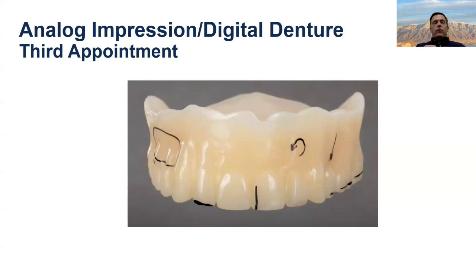If you're not satisfied with the fit, you can take a reline impression in it. Your laboratory can rescan the case and update the fit, because this fits the same as the final denture. Unlike with the analog process, the intaglio is exactly the same. So you don't have to wonder, will it fit better? Will it fit worse? The final will fit exactly the same. So this is one of the ways that this process adds a lot more predictability to your dentures.